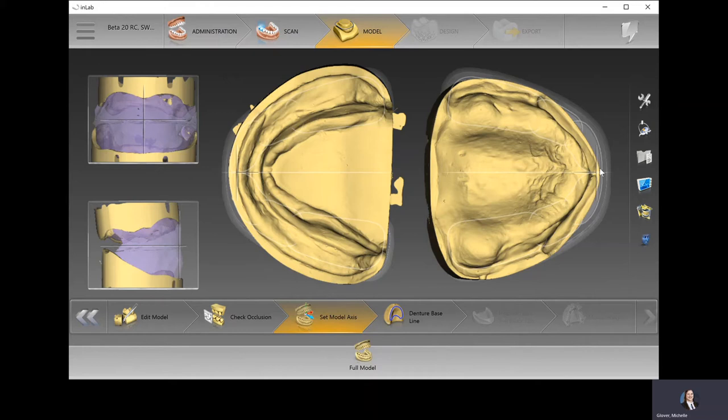So we're able to set up things like our midline, and then on the upper left, we have another visual of the midline and the occlusal plane in the anterior region. And then the lower left directly affects the occlusal plane of our posterior region as well. So you're going to want to consider things like the curve of Spee when it comes to designing your dentures. This is the point where you want to determine the best fit occlusal plane from just one straight line.